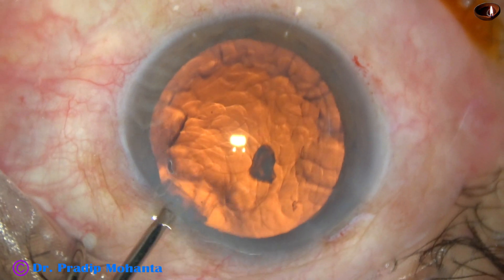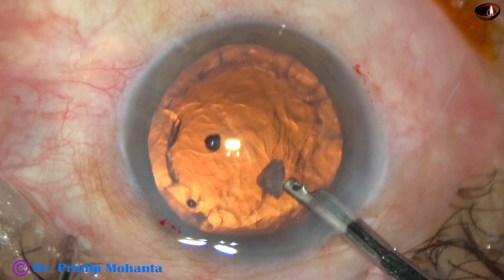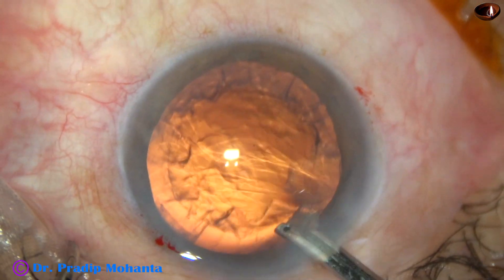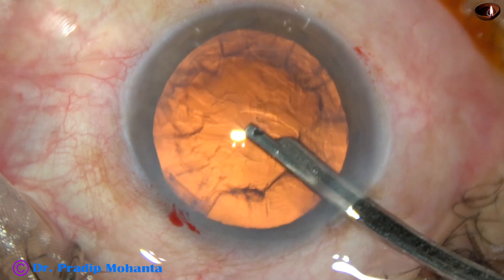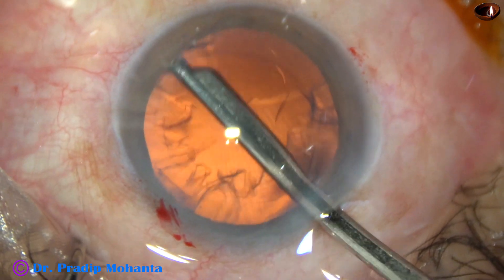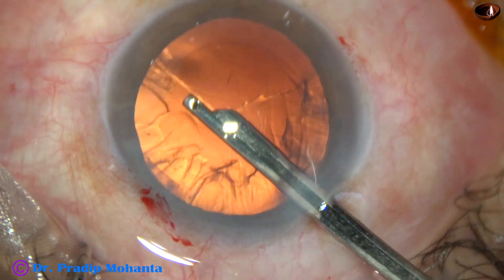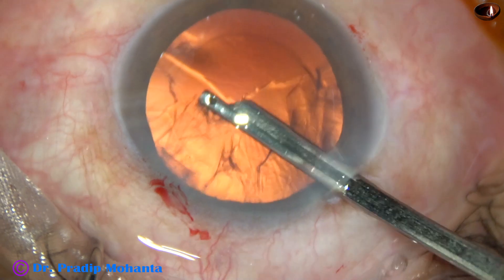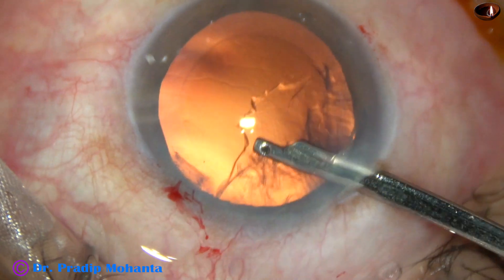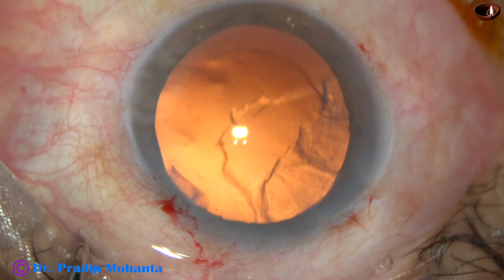Now is the time to remove the cortex. We can see two small bits of nucleus — those are to be removed first. By the time my assistant gets ready with bimanual irrigation aspiration, I am removing some cortical lens matter with this beautiful instrument — it is a 23G Simcoe cannula attached to a separate bottle of BSS. And by the time my assistant gets ready with bimanual, I can remove this much of cortical lens matter.